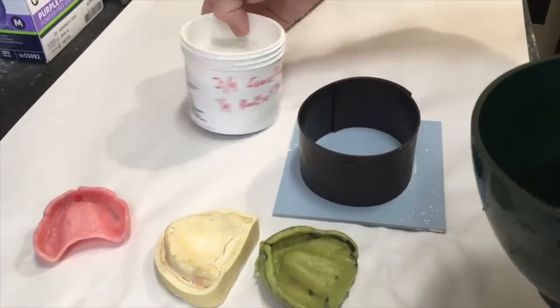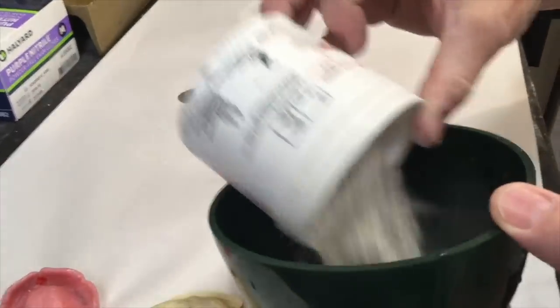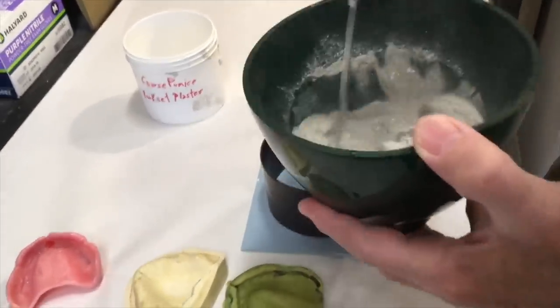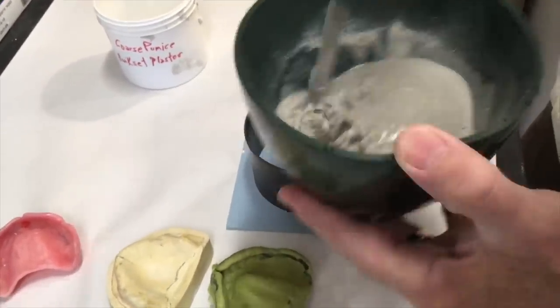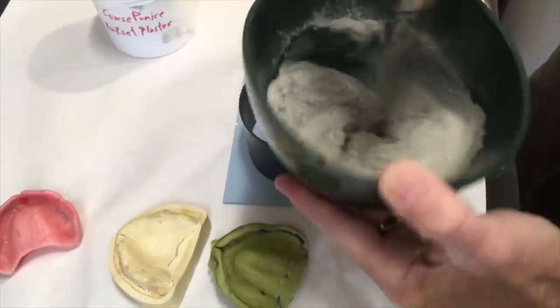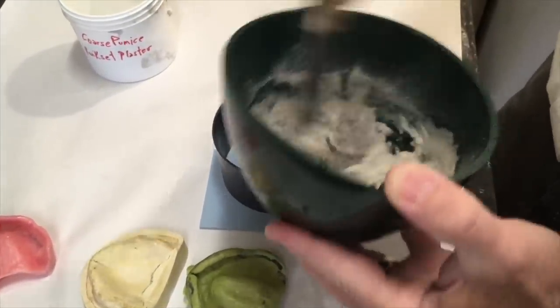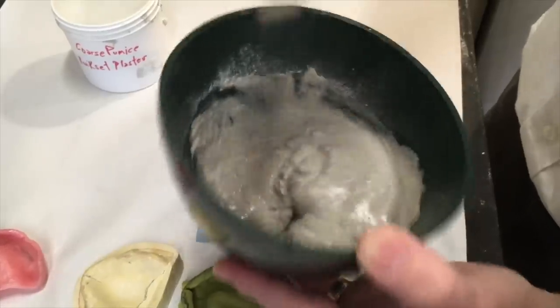I've got water, three-quarters coarse pumice and one-quarter quick-set plaster. I want a consistency about like stone — not real runny, not so thick that I can't push the impression down into it. Just mix it up to about that consistency.